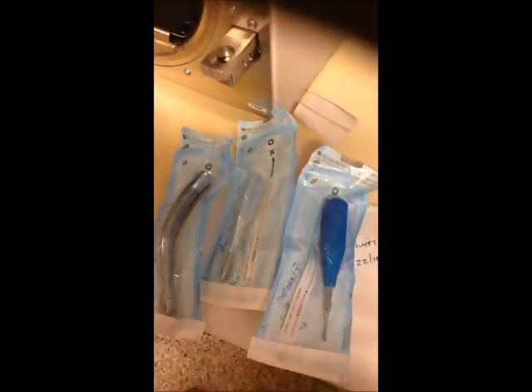Okay, our autoclave is finished. So I'll just show you the indicator strips. They say okay on them. This is a needle driver that was wrapped earlier. The needle driver has the date and the equipment written on it. Our strip has all indicated that the autoclave has reached temperature to change the indicator strip. The same thing with the tape.